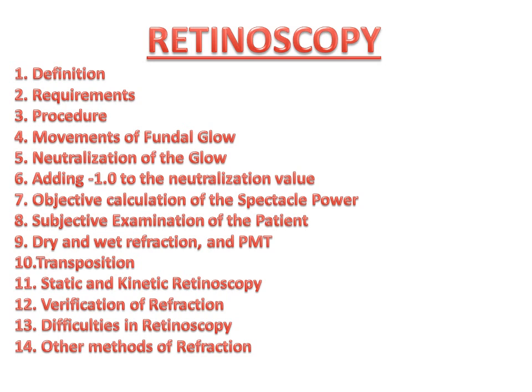You should have a knowledge of how the fundal glow moves in retinoscopy. Next, after identifying the fundal glow, you should be able to neutralize it. After writing down the neutralization values for the fundal glow, you have to add -1 to the neutralization value. Next step is to objectively calculate the spectacle power.